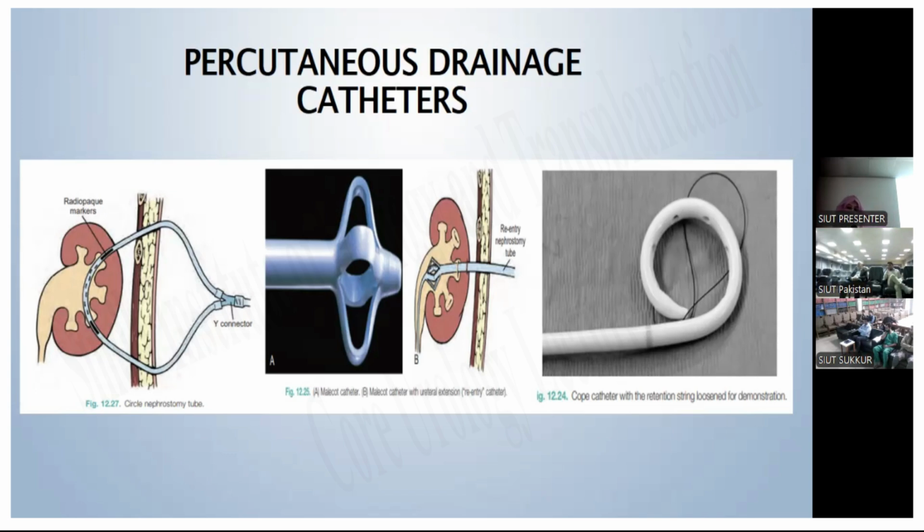So when I was a resident in my first year, and Dr. Munawar was also there, we used to have this Malecot catheter available to us for suprapubic placement whenever a person comes to us with a lot of clots in the bladder and perhaps bladder growth. Those were the days when there was no oncology clinic, no oncological service as such, but there were oncological patients. So if we placed a suprapubic catheter, the catheter would block.